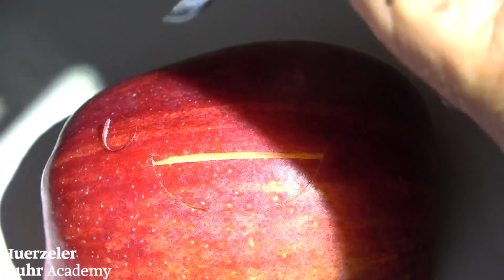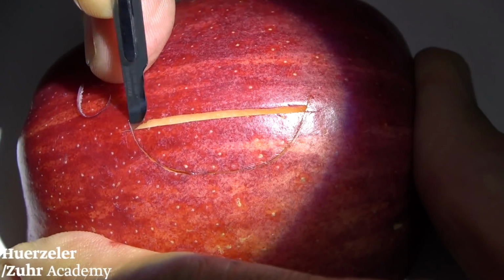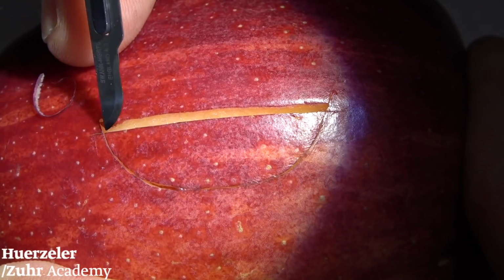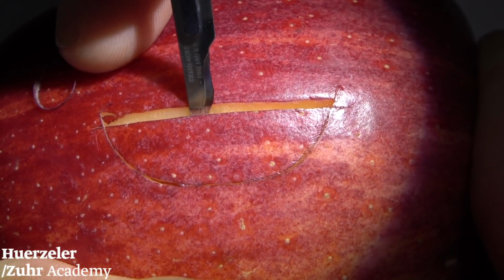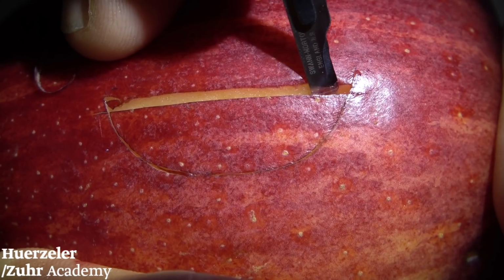So you need a blade with a wide surface, and with this blade I can work another 30 degree and I can start to push the tissue out like this. So now I start to push the tissue out. And I angulate my blade.